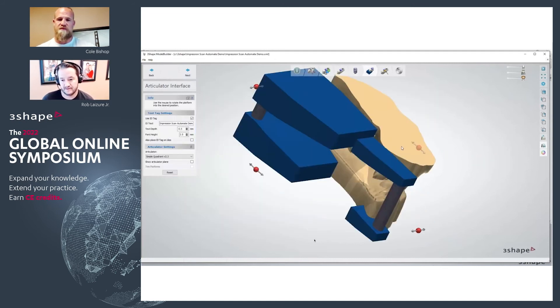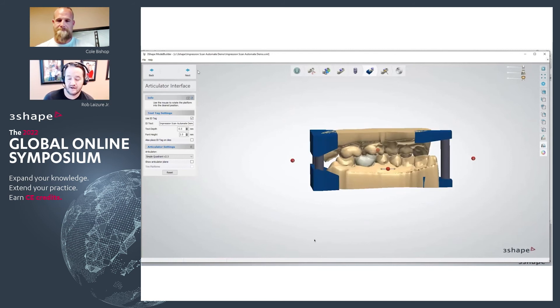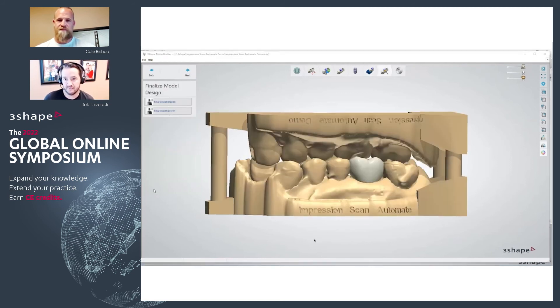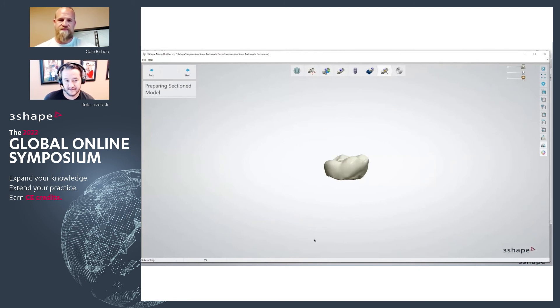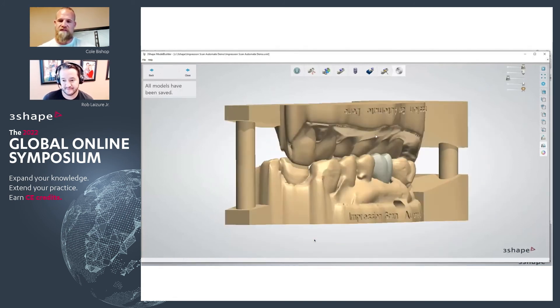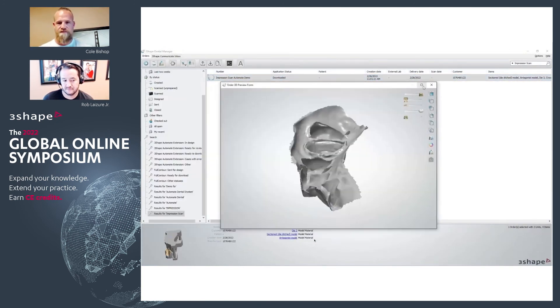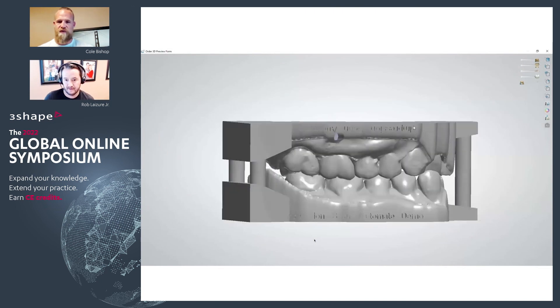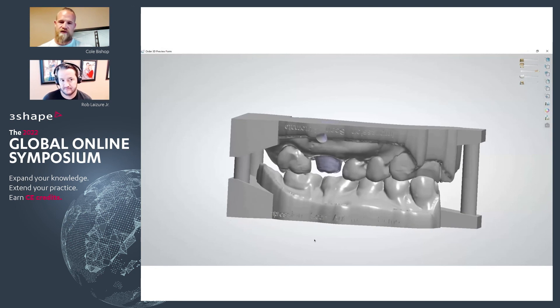It's a pretty straightforward, simple process. Mark the margin, automate crown, bring it back in, design your model, and it all fits beautifully. We have quite a few users following this workflow and seeing some great results with it. You can do a quick 3D preview and see the removable die, the crown — everything has been maintained between both the model and crown design.